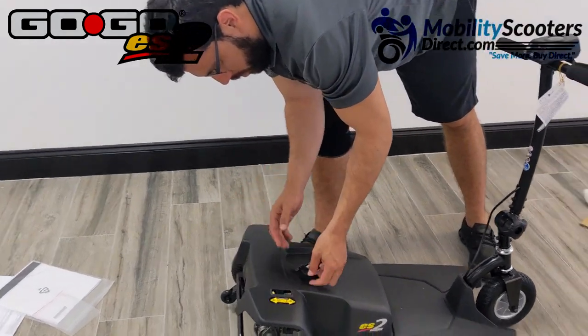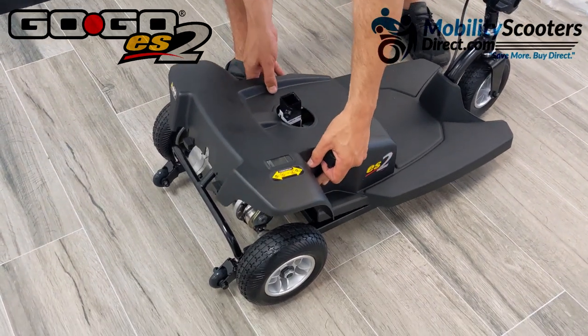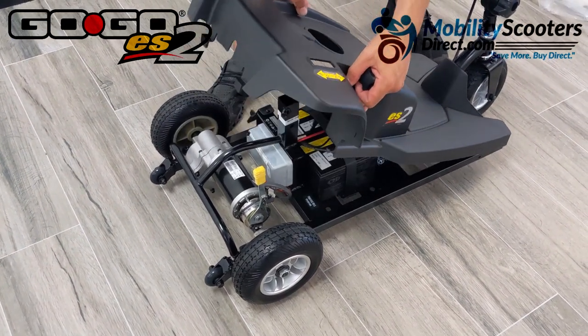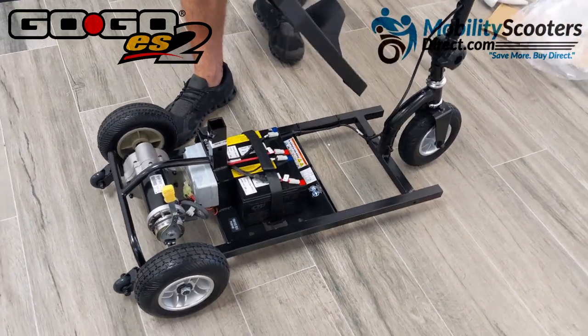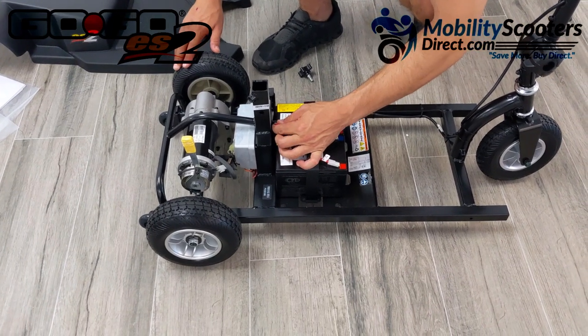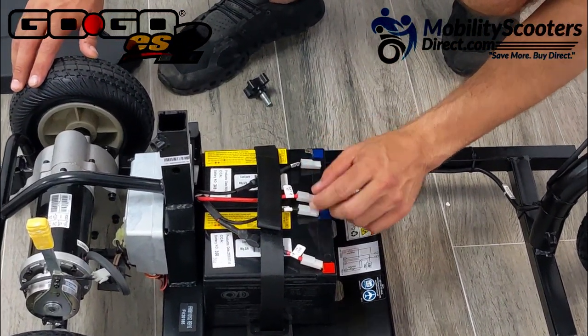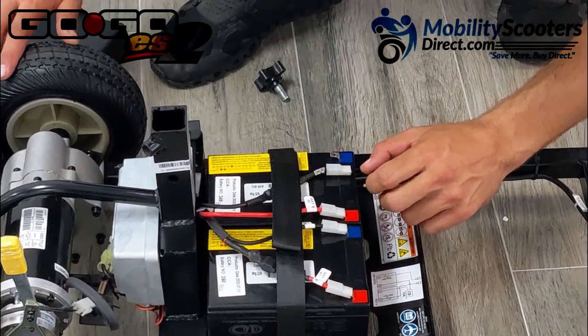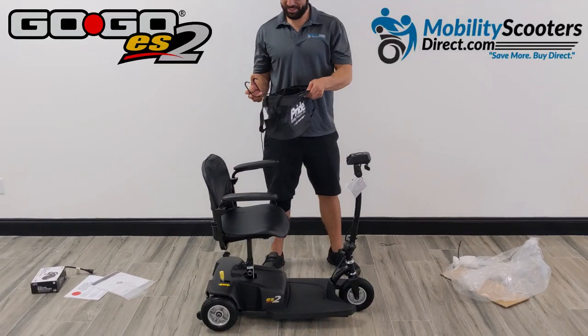Now we'll show you that the batteries come disconnected for safety during shipping. To connect them, remove the floorboard by prying it up softly from the back — you don't want to break the shrouds. You'll notice one of the terminal connectors is not connected, to prevent the batteries from draining during shipping. Go ahead and connect that negative terminal, then put the shroud cover back on and you'll have power.